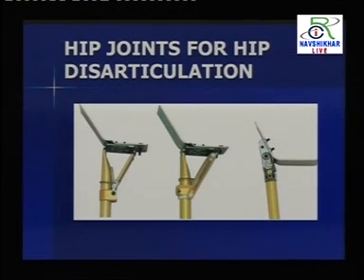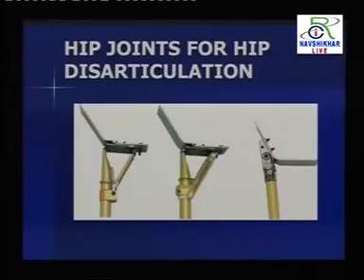The patient will be comfortable to walk with this. Yes, with this prosthesis they are definitely comfortable. You have seen the little girl. She is walking without any support. Comfortable, but they need more effort to walk, because it is not like other prosthesis.